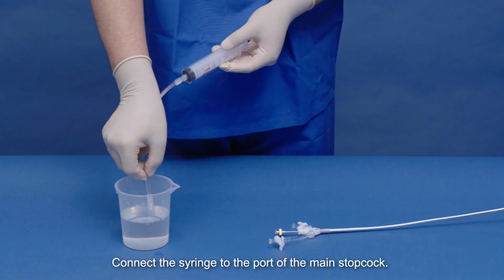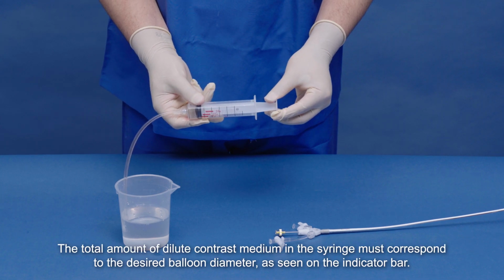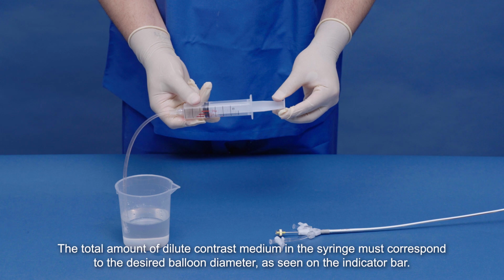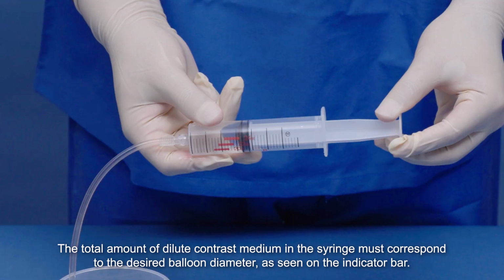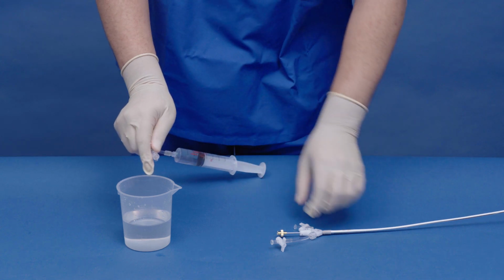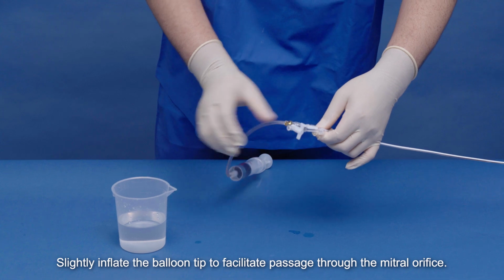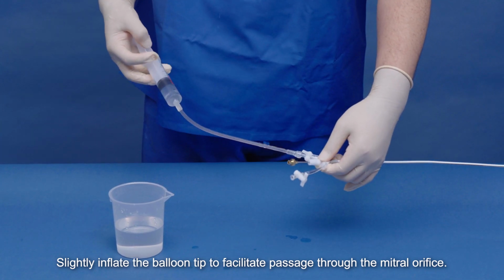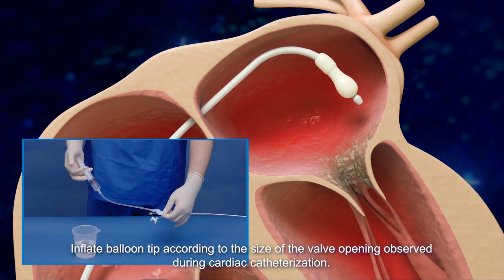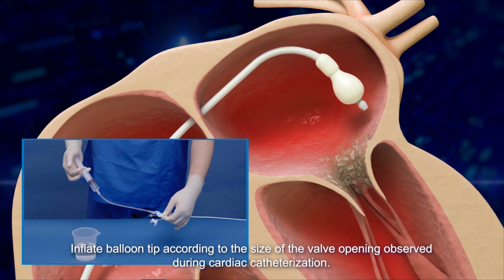Connect the syringe to the port of the main stopcock. The total amount of dilute contrast medium in the syringe must correspond to the desired balloon diameter, as seen on the indicator bar. Slightly inflate the balloon tip to facilitate passage through the mitral orifice. Inflate the balloon tip according to the size of the valve opening observed during cardiac catheterization.